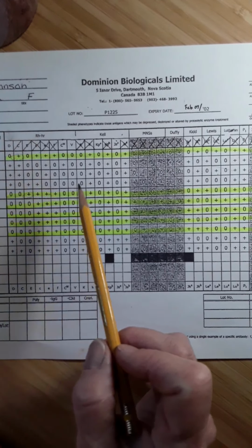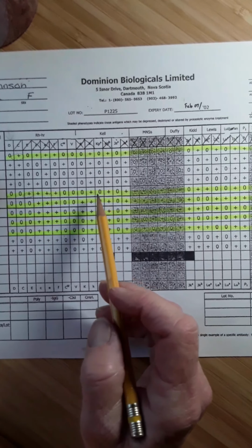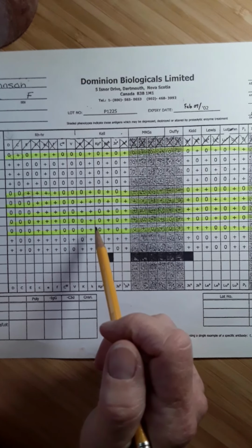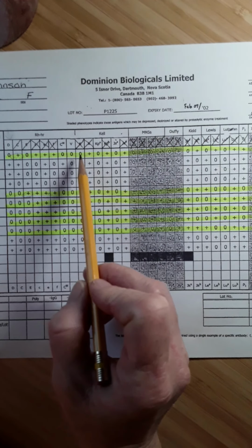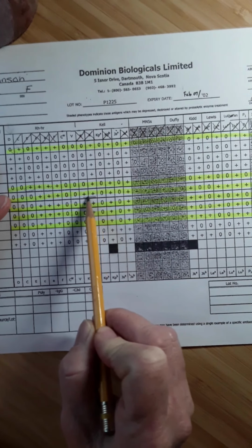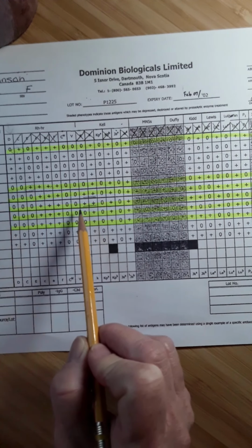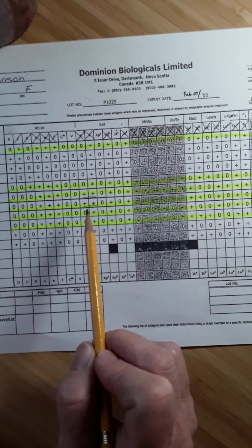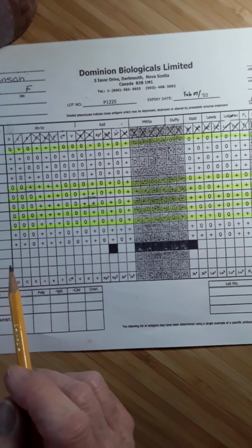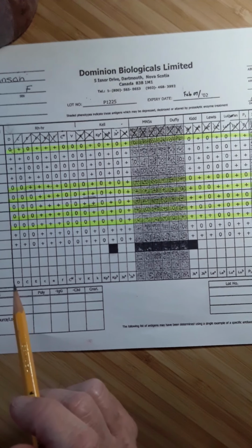Then I went on to Kel. Often students will not have crossed out Kel because they're looking for a homozygous Kel cell that did not react. That's true. In this case, we've got a heterozygous Kel cell that did not react and another heterozygous Kel cell that did not react. But if you look at the rules on page 9, Kel is not listed as one of the antibodies in 3 Roman numeral 1 that shows dosage.